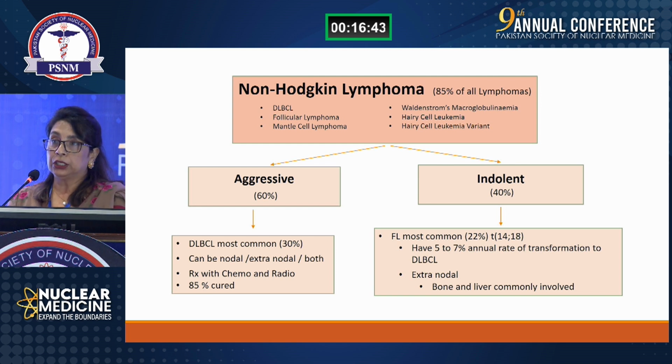Both the Hodgkin's and the non-Hodgkin lymphomas are generally very FDG avid. Some of the non-Hodgkin lymphomas do have questionable uptake, such as mantle cell and others, but FDG does help in the diagnosis and further treatment management in these cases too.